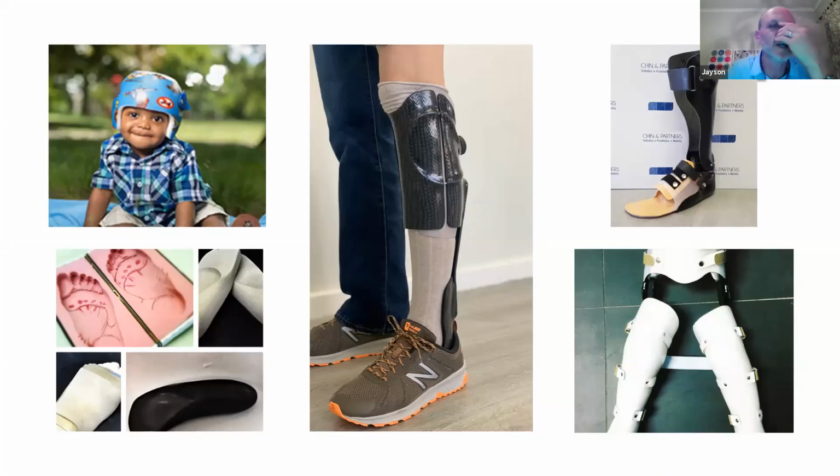It's got a carbon strut that goes down the back. This allows energy return and a very effective brace. We often use these in failed ankle replacements, severely arthritic ankles.